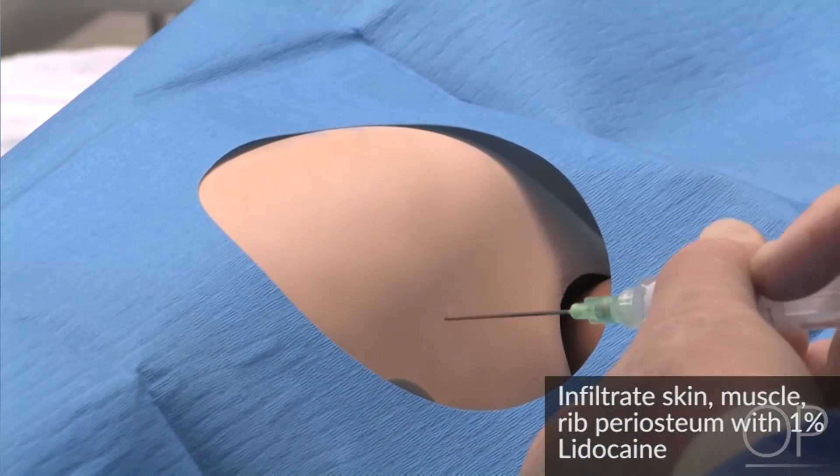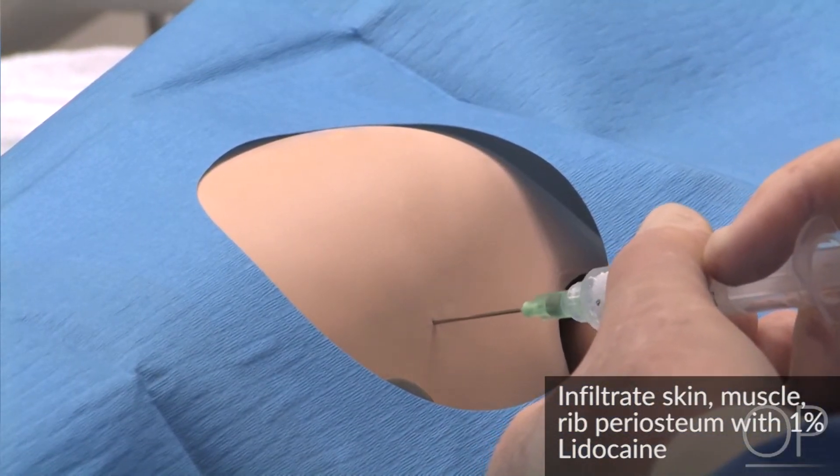Infiltrate the skin, muscle, and the rib periosteum with 1% lidocaine.